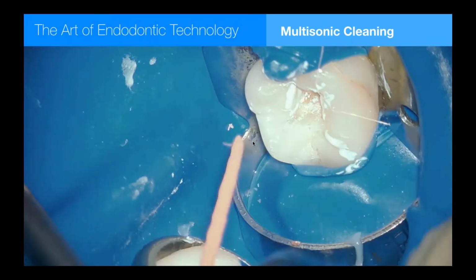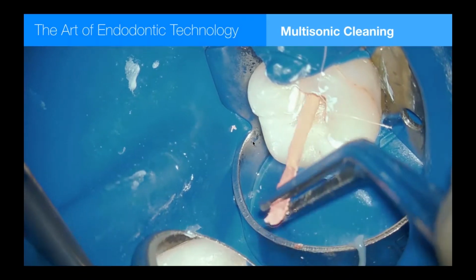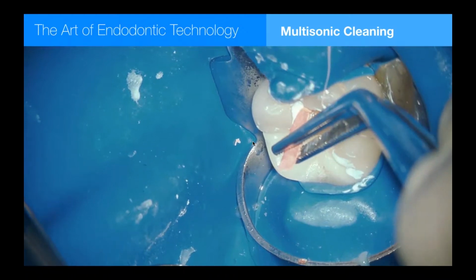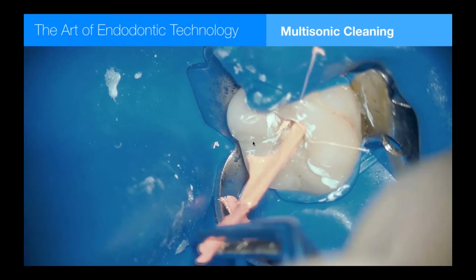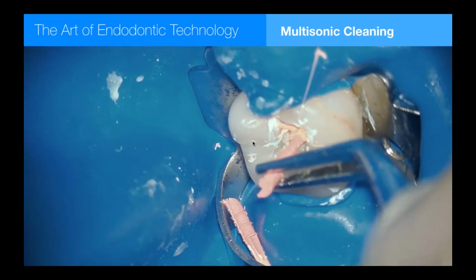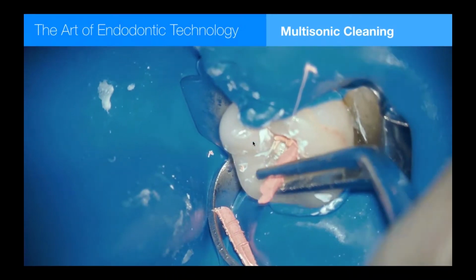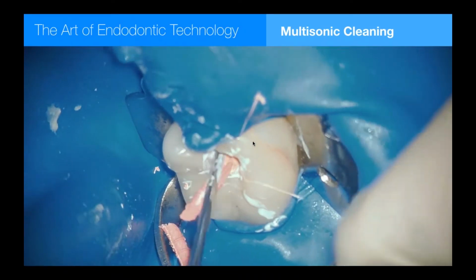And here comes a gutta core carrier in the mesiolingual canal. Take it out of the oven and break off the handle in the stop because it's always in the way if I don't. Take that off. Here comes the second one from the mesiobuccal canal. Put it in about 3 to 4 seconds is correct. Don't worry if it hangs up short of your measured length, because in most cases it will have filled all the way to the end of the root canal.